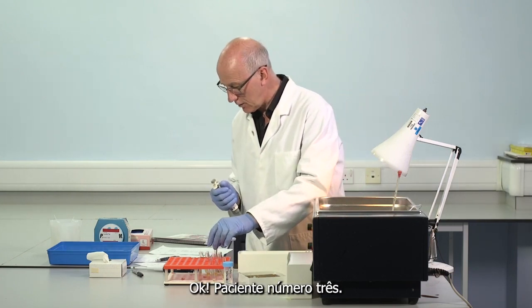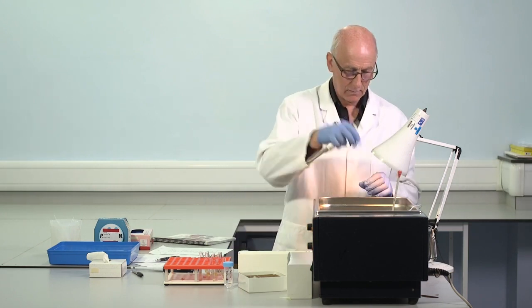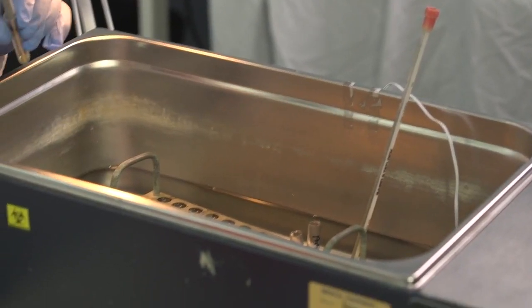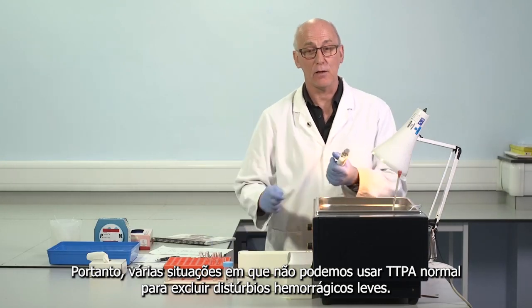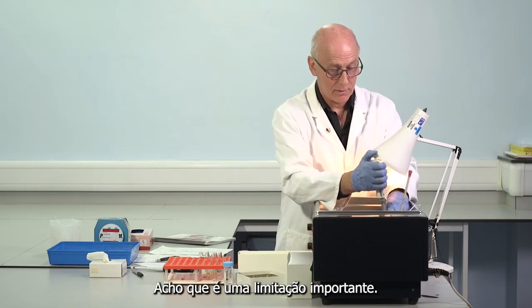Okay, patient number 3. So a number of situations where we can't use normal APTT to exclude mild bleeding disorders. I think it's an important limitation.